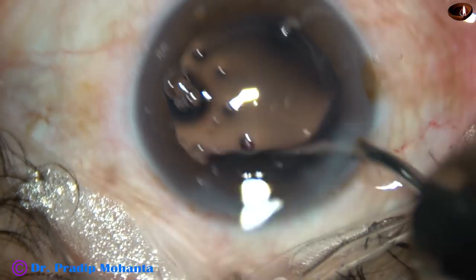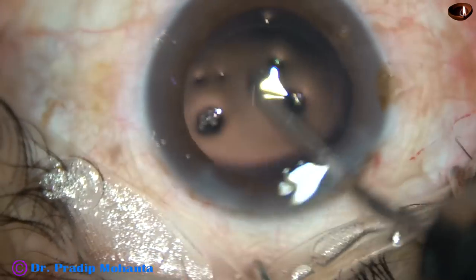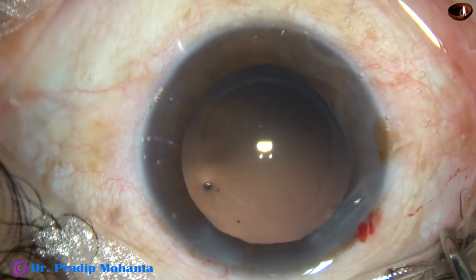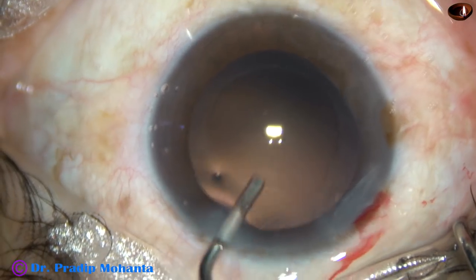This is how you can do it. The irrigating fluid is directed towards the posterior capsule. The irrigating probe is moved to and fro and the posterior capsule gets nicely polished.